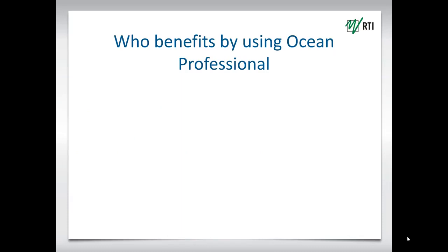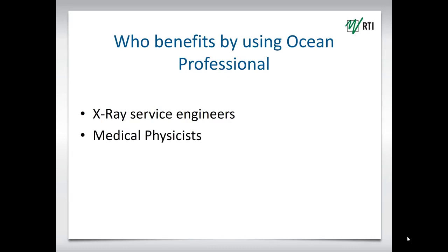Who benefits by using Ocean Professional? X-ray service engineers who work for hospitals, service groups, ISOs, the U.S. military, and X-ray manufacturers. Medical physicists who inspect and oversee X-ray imaging devices. Local and state and U.S. government inspectors of diagnostic X-ray imaging devices.